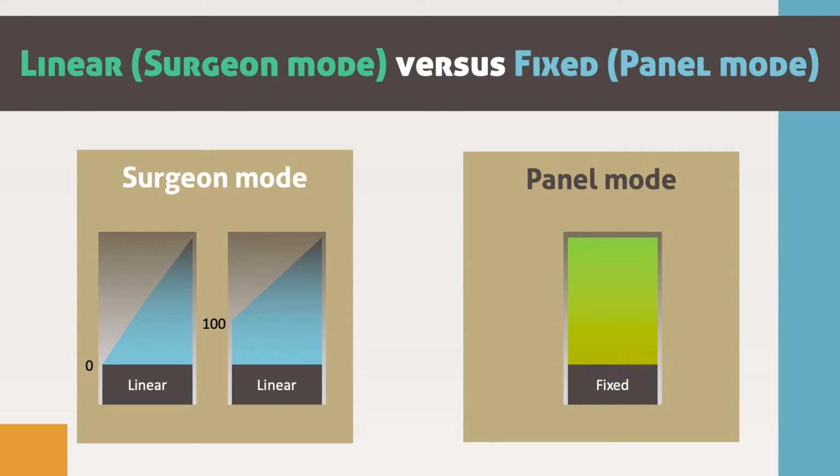For example, if the aspiration flow rate is on fixed 30, once we reach step 2, the 30 will be reached immediately. So the maximum preset aspiration flow rate, which is 30, will start immediately. We will not start from 10 or 15 or 0. Also in ultrasound, if we set the power on 70% panel mode, a full 70% power will start once we reach step 3.